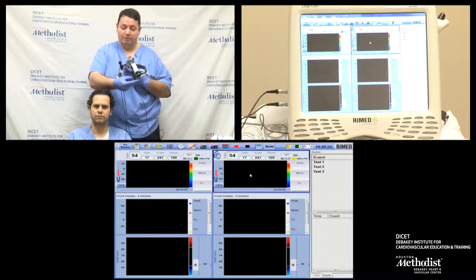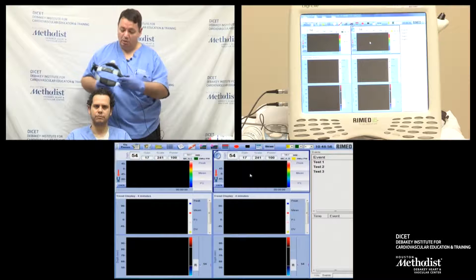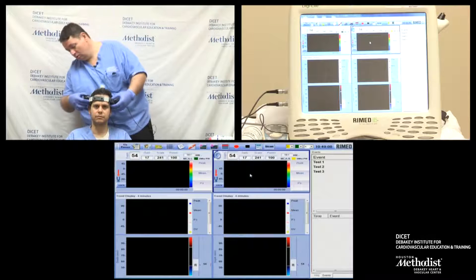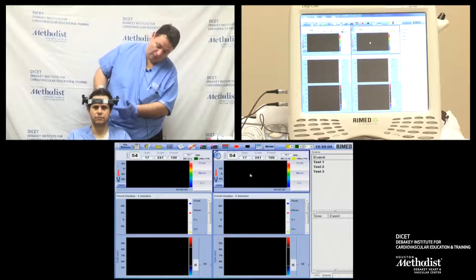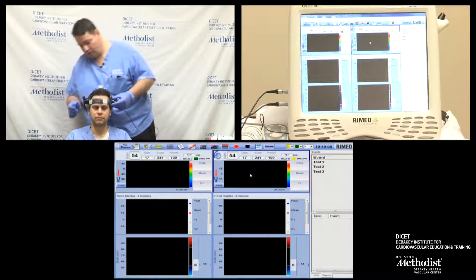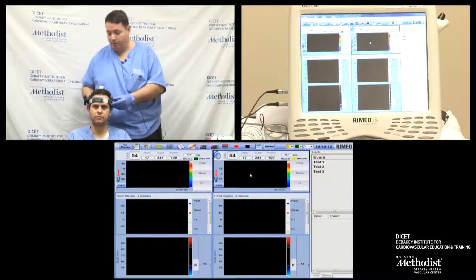We have the ultrasound headframe prepared with two monitoring probes. I'm going to place the headframe on the head about an inch above the ears. I'm tying the headframe first, and then I'm going to tie it on the top as well.